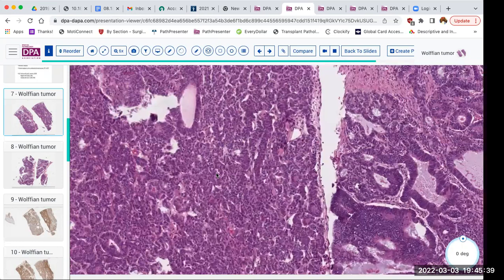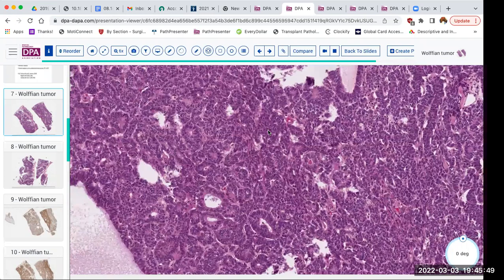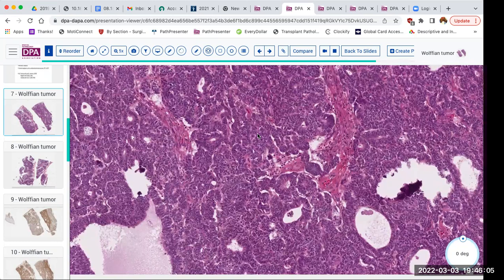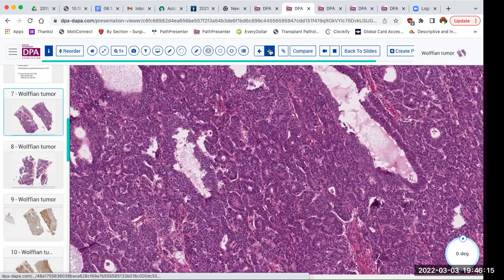But I also noted that it tended to have other intervening solid or stromal-like elements that merged to a degree with this tumor. So I didn't come out and say endometrioid carcinoma. I said this is an epithelioid neoplasm, could be endometrioid carcinoma, but I'm not totally sure. So they proceeded to resect and did some staging biopsies as well. I'll show you another section of this tumor.